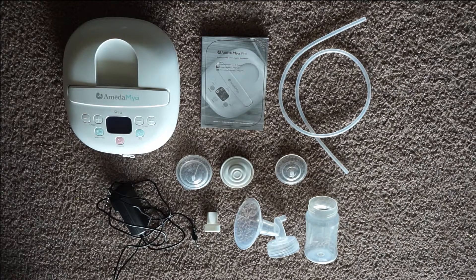This is the stuff you're going to need to set up for single pumping. If you wanted to double pump, you would just repeat the process with the tubing and parts, but to keep it simple, I'm just going to be showing you how to set things up for single pumping.